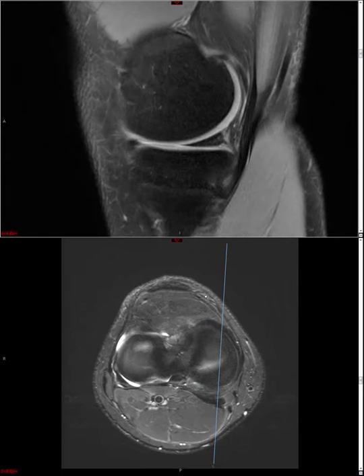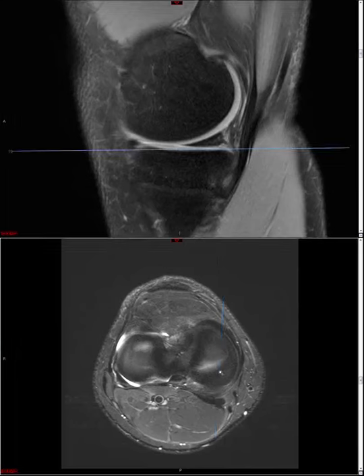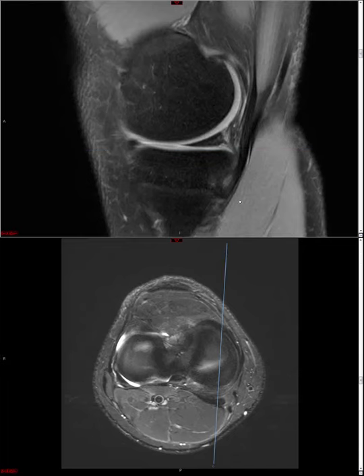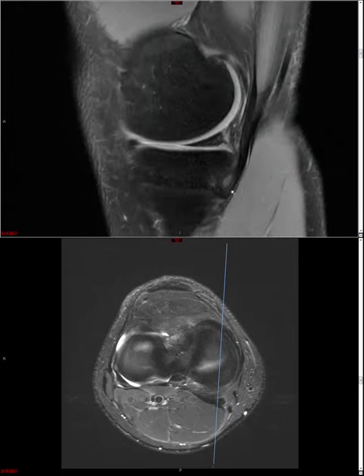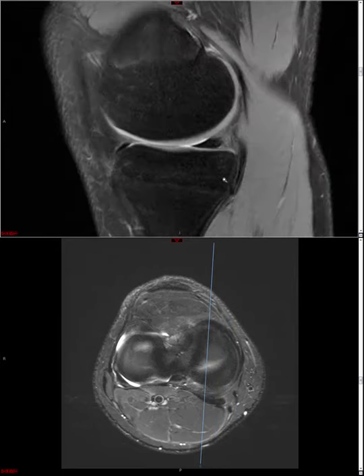Contrast that with a tear that is oriented perpendicular to the meniscal fibers, and you have a so-called radial tear. And that sort of tear manifests usually as something like this. So you're scrolling through your meniscus, it looks fine, it looks fine, it looks fine, and then suddenly you get to one image where either the meniscus looks markedly truncated or it looks grayed out or it looks white.